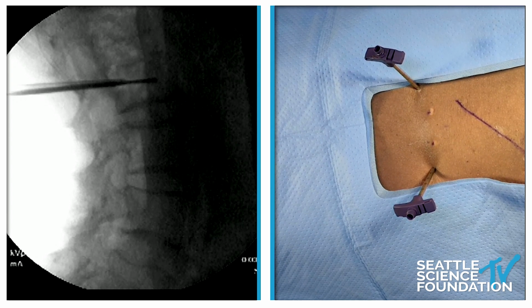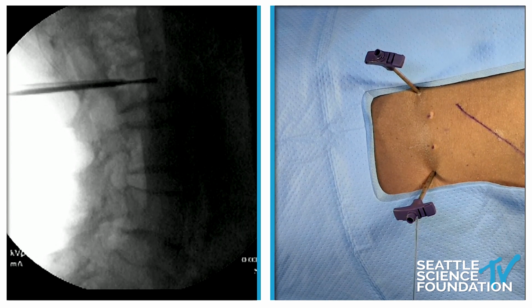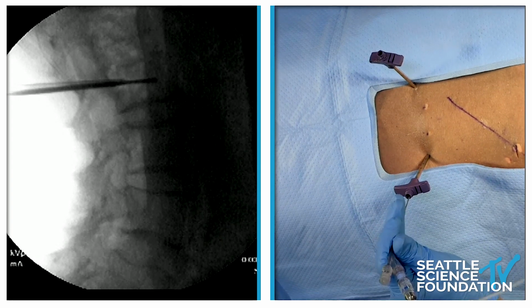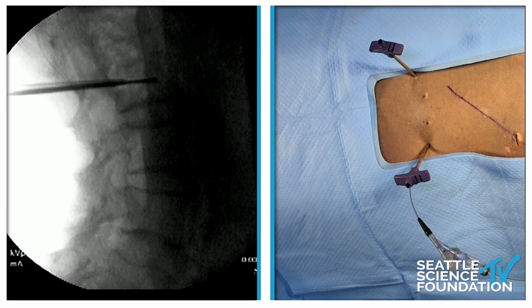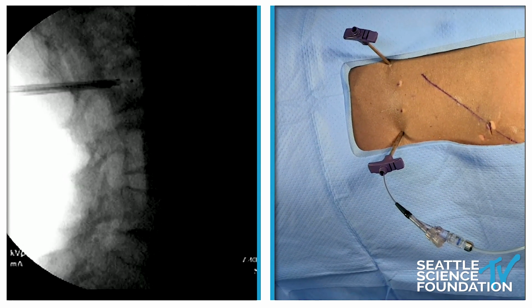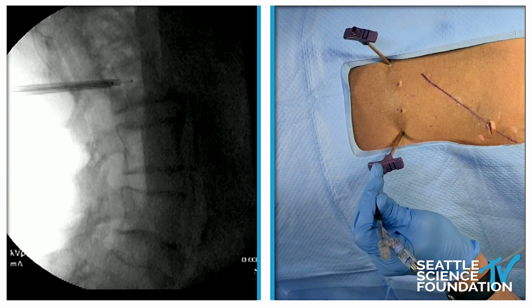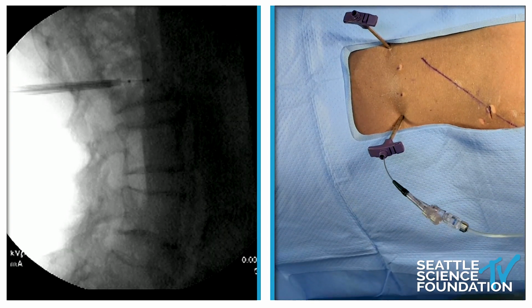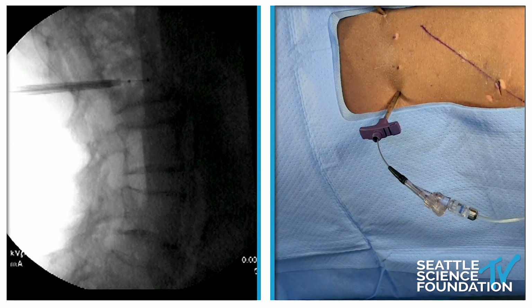You commonly anesthetize as you go forward? Yeah, and sometimes if you have a lot of pain, people have pain from marrow changes, pressure changes. What I'll do is I'll inject lidocaine directly into the vertebral body, and that anesthetizes the nerve, the basivertebral nerve, and you get appropriate anesthesia.